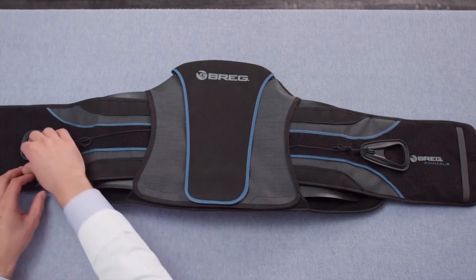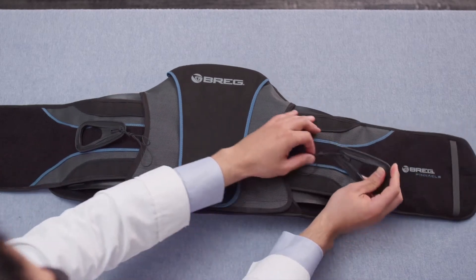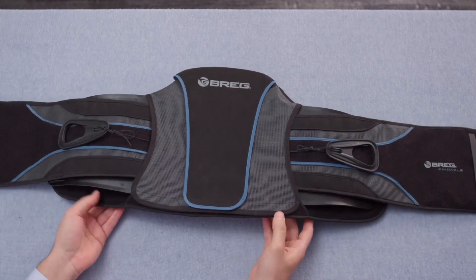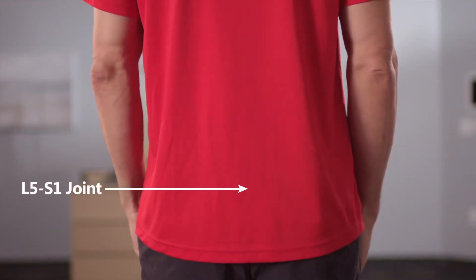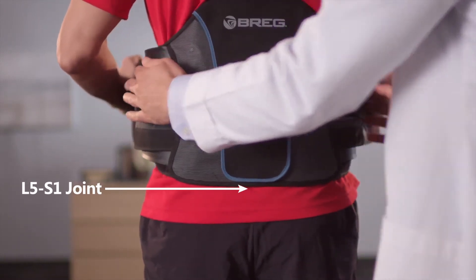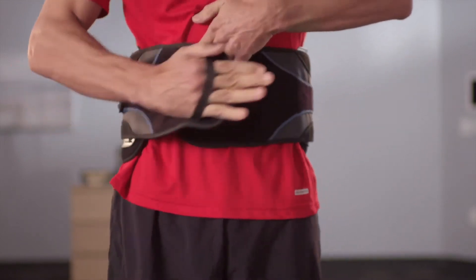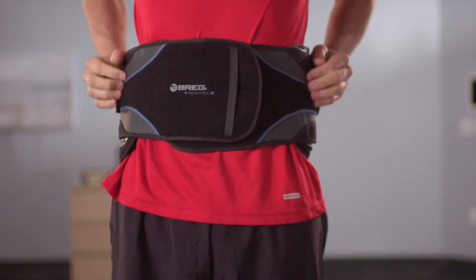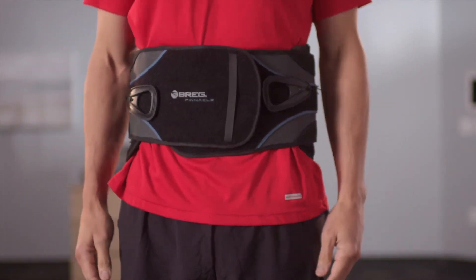To apply the lumbar products, start by opening up the belt and positioning the lacer poles as close to the lacer system as possible. Pull both belt panels out to achieve the maximum lacer system extension. Approach the patient from their back and identify the patient's L5-S1 joint. Apply the lumbar belt with the bottom edge at that point. The patient completes the application by taking the left belt panel and laying that down first, then taking the right belt panel and overlapping to secure the hook and loop together. Finally, the patient takes the pull handles, pulls them out and away from their body, and wraps them down to engage the hook and loop at the desired compression level.